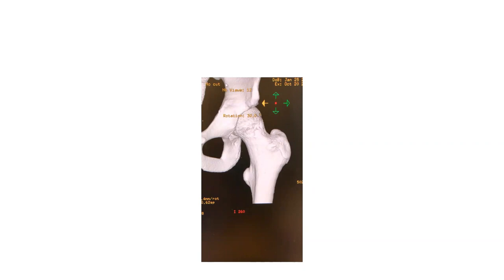Same goes for a CAT scan of the chest, abdomen, and pelvis for a trauma patient. If we have a patient that's obtunded, we will scroll through those series to look for an injury to the spine because, since it's in the same field of view, FOV, we may pick up a subtle injury to the thoracic or the lumbar spine if we look carefully at those studies. And the radiologist will look at those too.